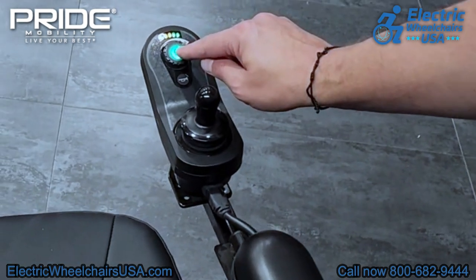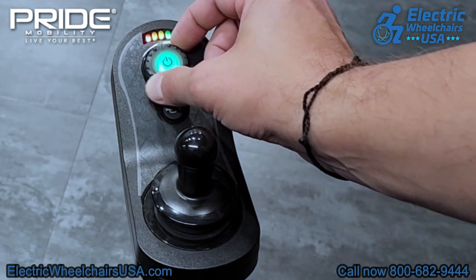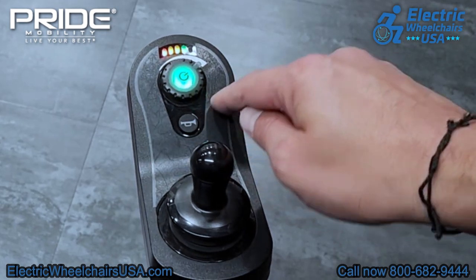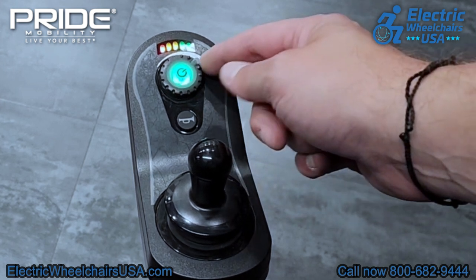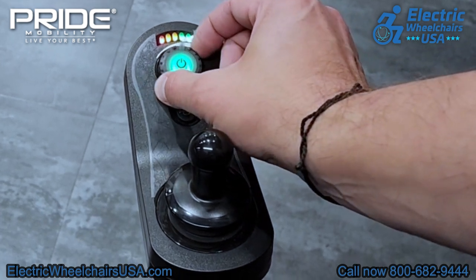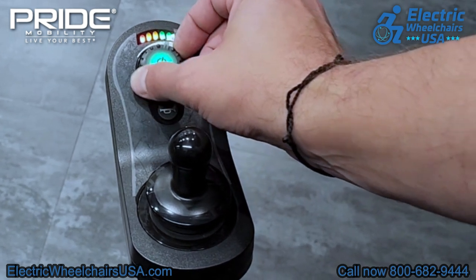This button in the middle is your power button — that's how you turn it on and off. Around the on and off button is your speed control dial. If you turn it all the way to the right, you get the maximum speed of four miles per hour. If you turn it all the way to the left, that decreases your maximum speed to about two miles per hour. So if you're going around crowds of people in public and want to be more careful, turn it down to the left. If you're out in the open and want to get to your destination quickly, turn it all the way to the right.